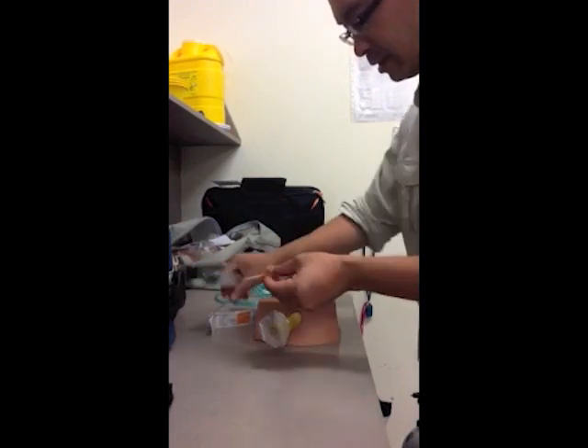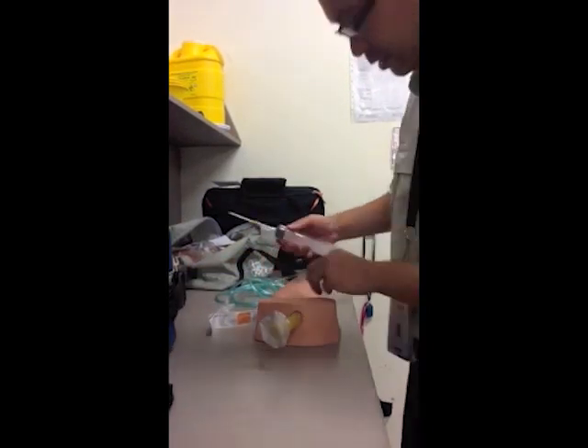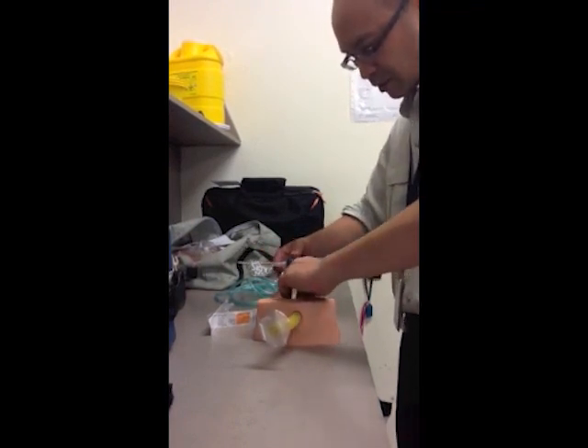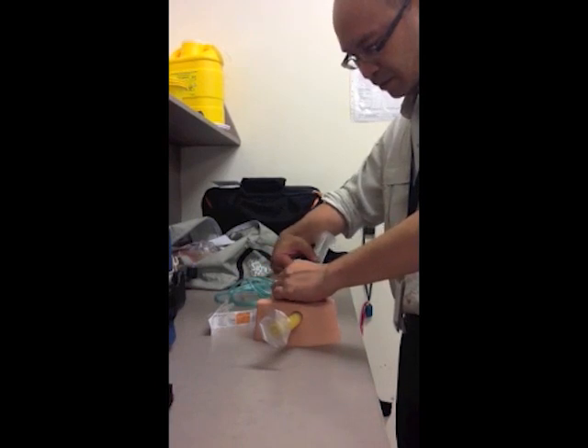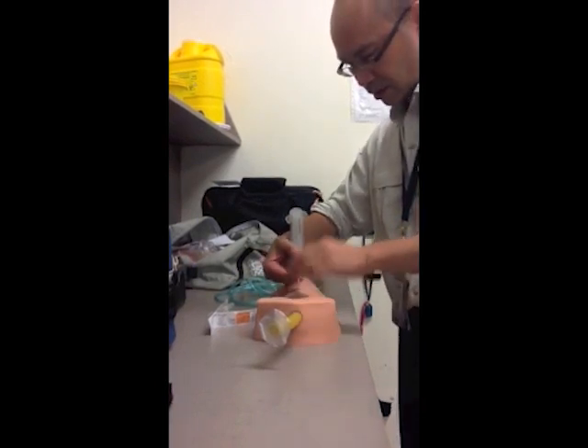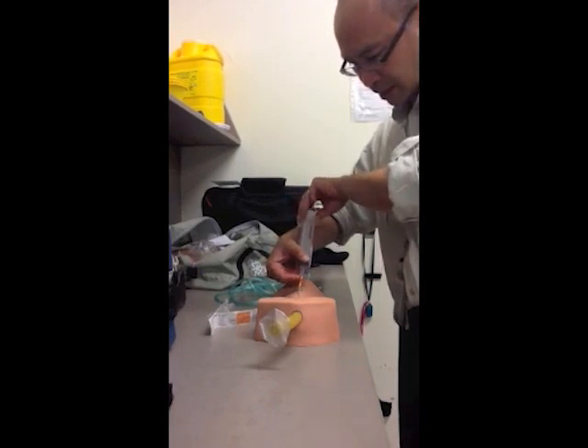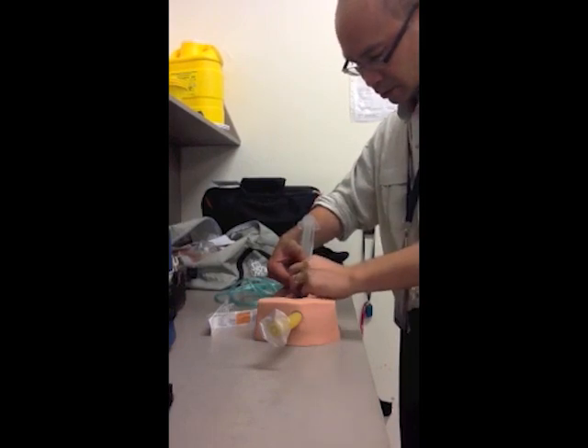I've taken out my catheter and connected it to a syringe, palpating the landmarks. I feel the thyroid, go down to the inferior border, and feel the cricothyroid space. As I'm inserting, I'm aspirating air — got air there. Push off the catheter.